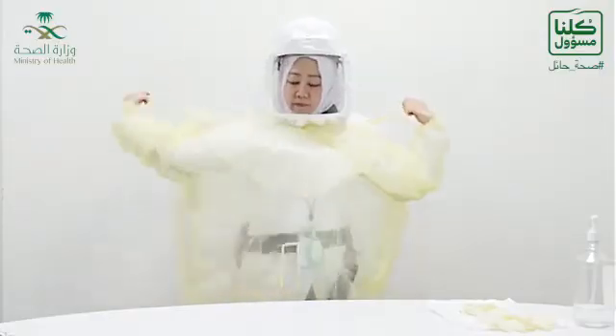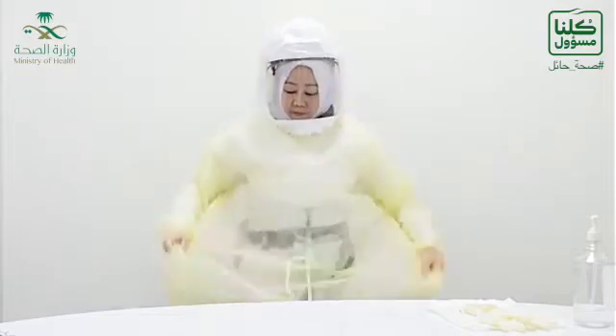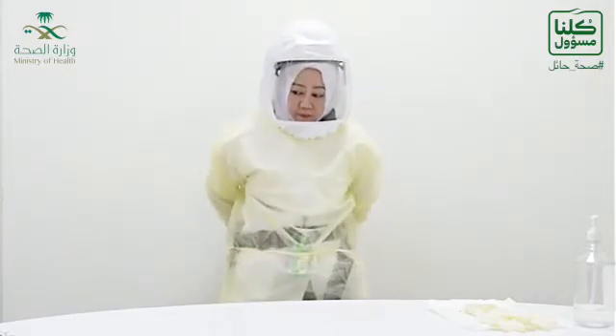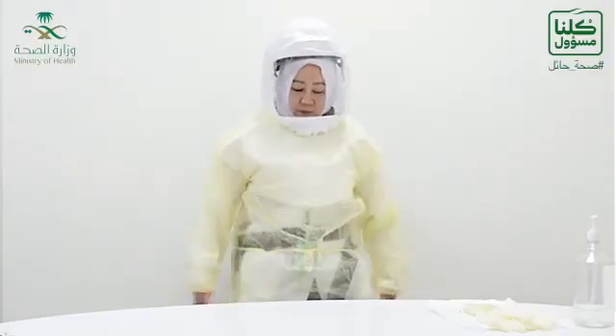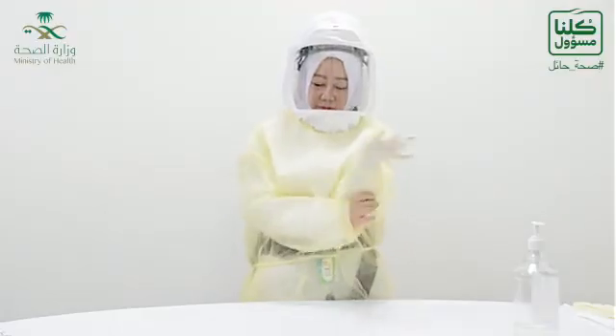Then you will don the gown, which will be applied above the hood. Then you will don the gloves.